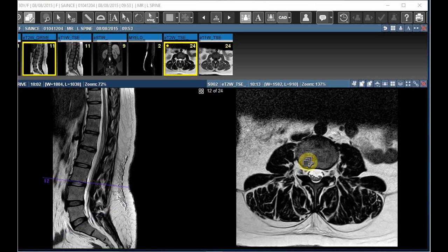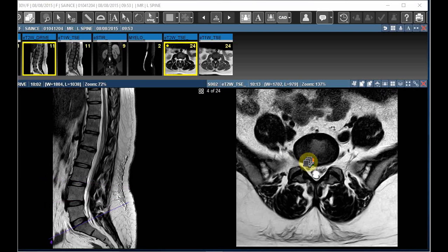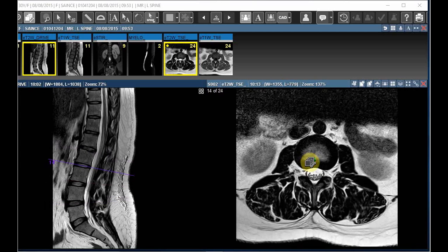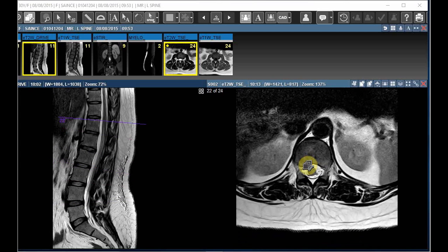Now I am going to explain the Automatic Spine Labeling Tool in MedgePacks. Usually doctors and technicians will do it manually with the help of reference lines. Instead of doing this manually, there is an Automatic Spine Labeling Tool in MedgePacks.